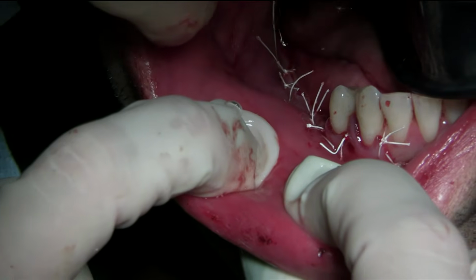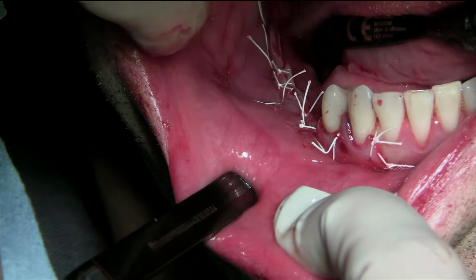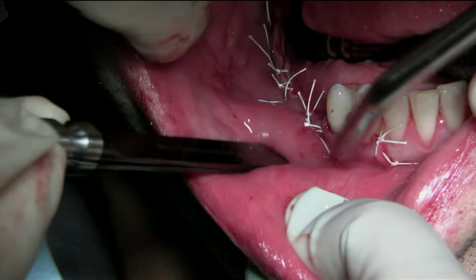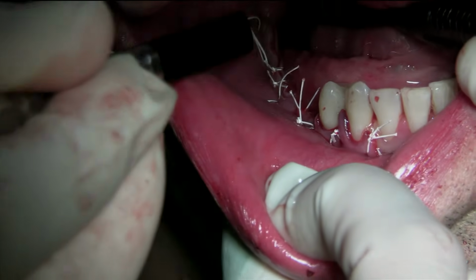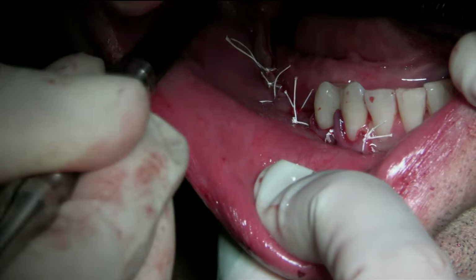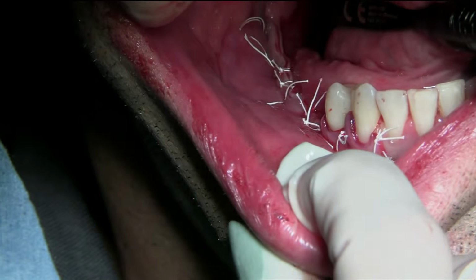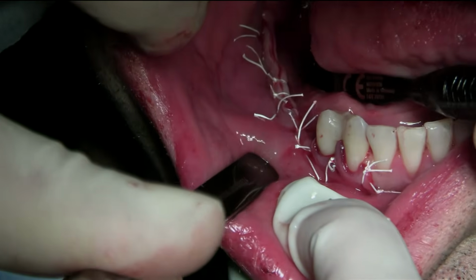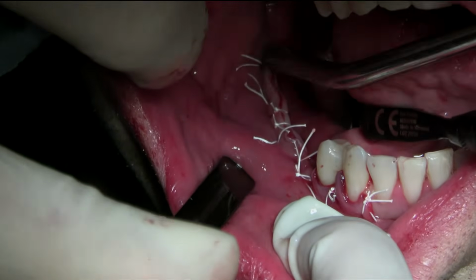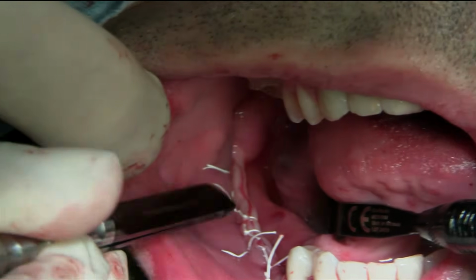So it looks to be already almost closed. Let's show it in the mirror. Let's show everything. What do you think? Here in the back, right? Yeah, I just need the back. Show me, it's dark. Camera. Chin down. Chin down. Copy. Okay, camera. Okay, good. I think this is good.